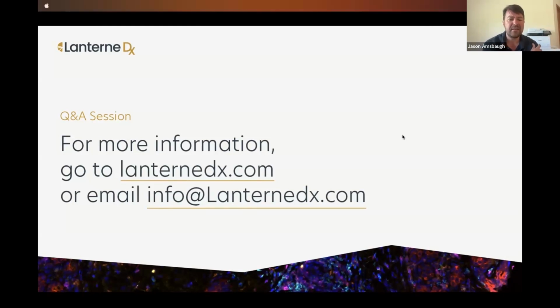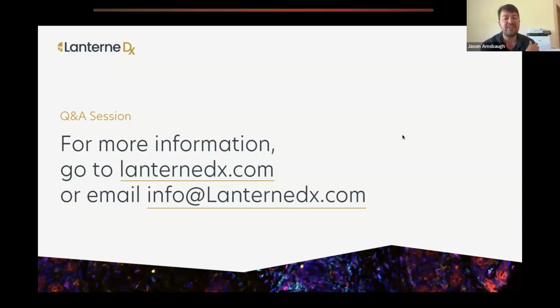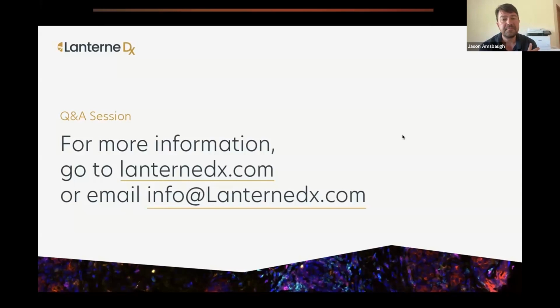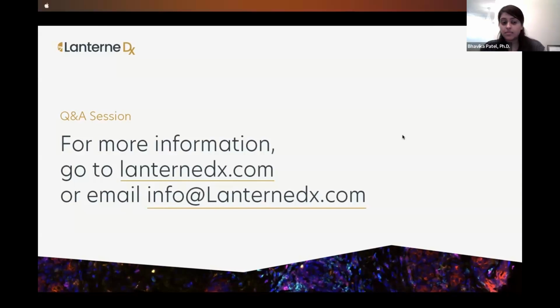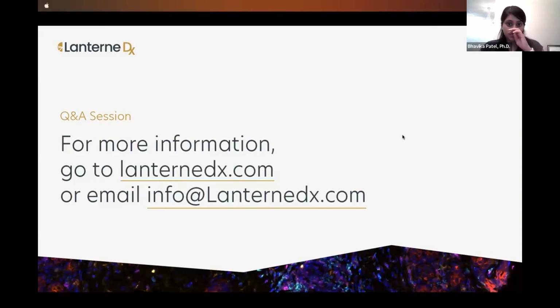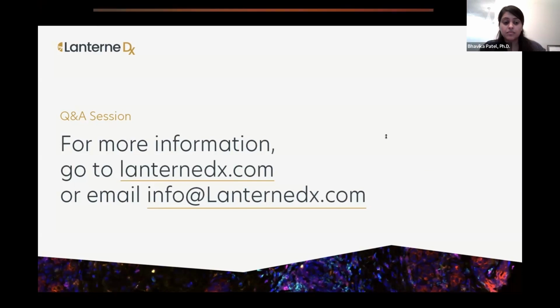This question is, how do you have confidence in digital image analysis when manual scoring by a pathologist is considered the gold standard? Yeah, so all of our image analysis is guided by pathologists, from selecting which samples to use for the training, as well as assigning any thresholds for each biomarker. We also have the pathologist QC the final data to ensure that it makes sense. And if not, we go back and work with the pathologist to update that app and make adjustments as necessary. Gotcha.